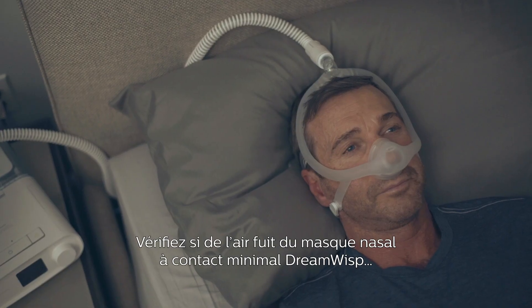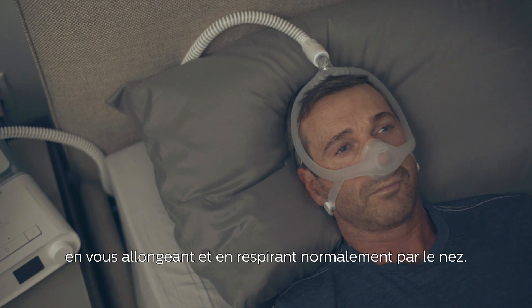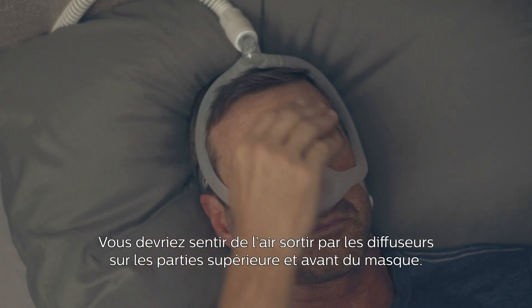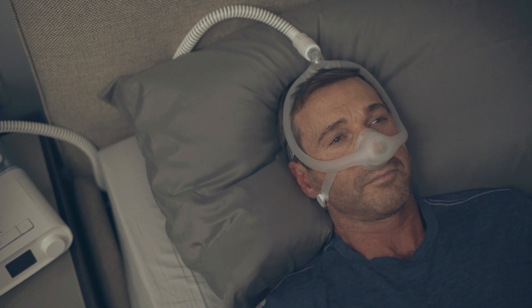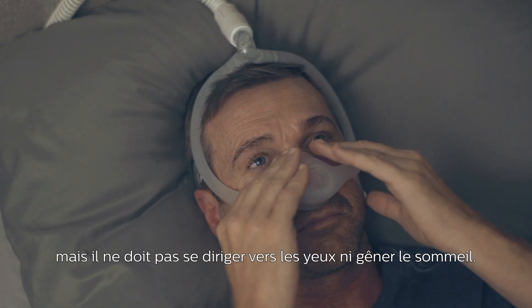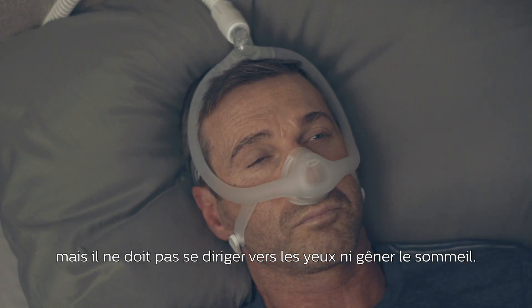Check the Philips DreamWisp Minimal Contact Nasal Mask for leaks while lying down and breathing normally through your nose. You should feel air escaping from the exhalation ports at the top and front of the mask. These must be left open to prevent re-breathing. It's normal to have some air leaking from your mask, but you don't want air leaking into your eyes or interfering with your ability to get a good night's rest.